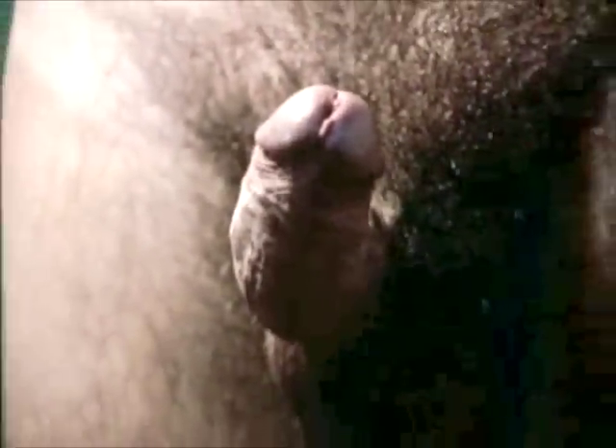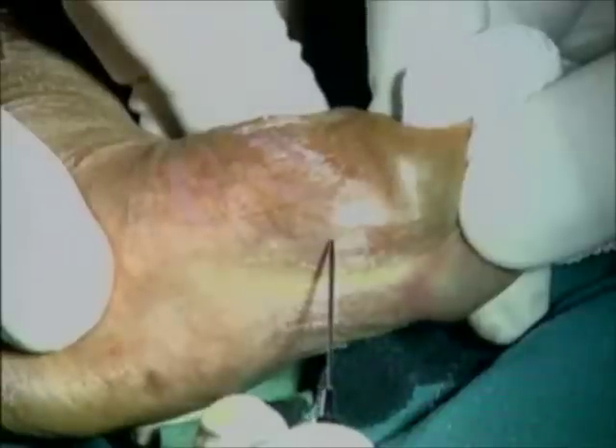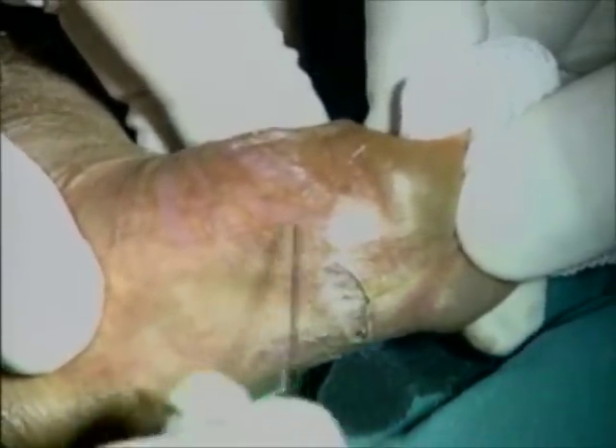The technique is performed during permanent erection induced by PGE1. A 54-year-old male with a marked 90-degree dorsal curvature located in the distal third of the penile body, associated with hourglass penile deformity. Surgery begins with two parallel skin incisions, the first being subcoronal, followed by a three-centimeter lower incision.